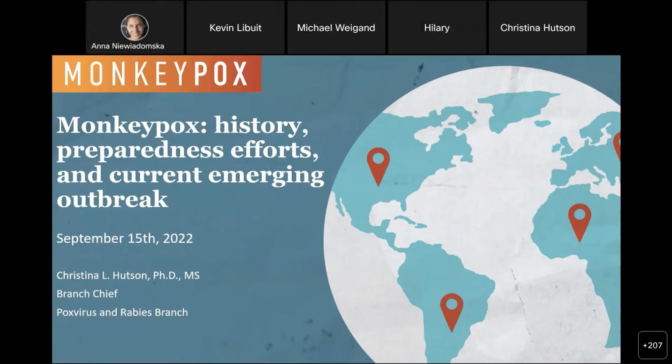We also have been interested in point of care tests, and GeneXpert is one many of you are probably familiar with. Again, we set out with developing a GeneXpert platform, or not the platform, but the reagents, for our smallpox preparedness work. For those who aren't familiar with GeneXpert, it's very small in size, so easy to set up in small areas and takes very little technical training to run. It's a closed cartridge, as you can see in the little schematic down there, and the extraction and PCR occurs within that cartridge. So minimum processing is needed, which is great for safety.